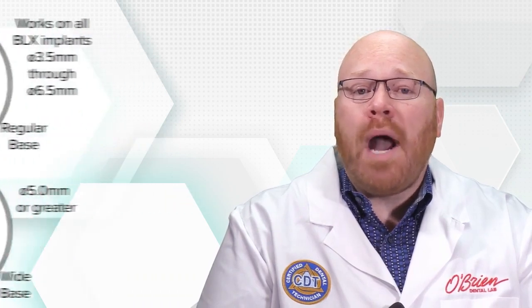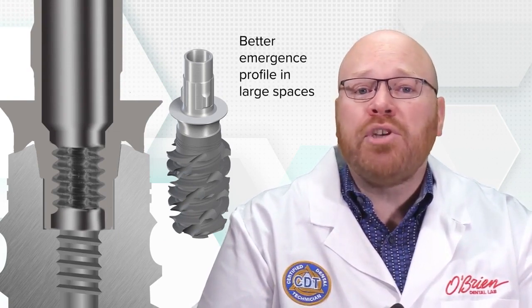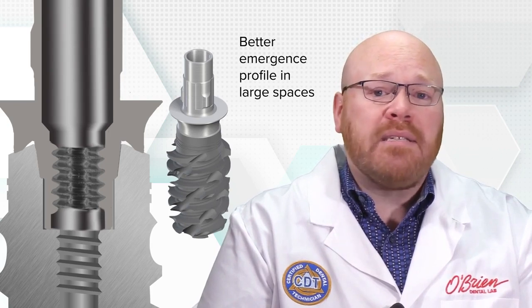These abutments have a wider diameter base that sits on top of the implant shoulder in addition to the internal connection. These additional restorative options can be helpful in creating a better emergence profile in large spaces.